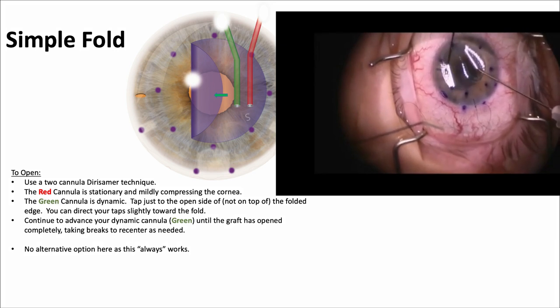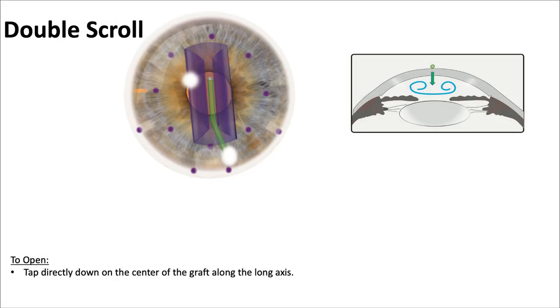So the one cannula holds still, and the other one taps on the fluid, and it opens right up. Wow, that's a neat trick.